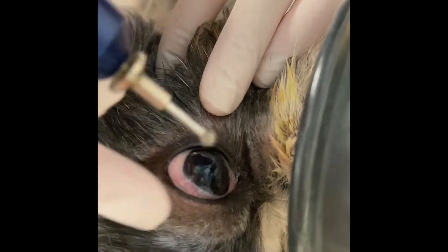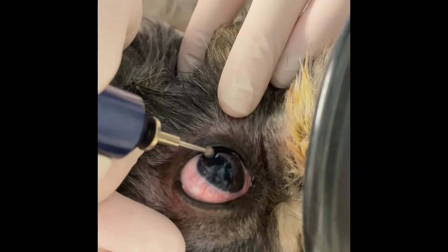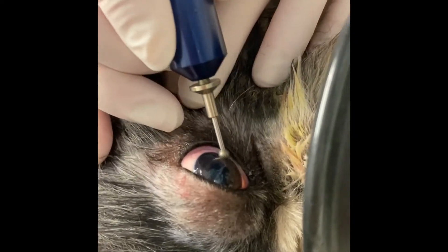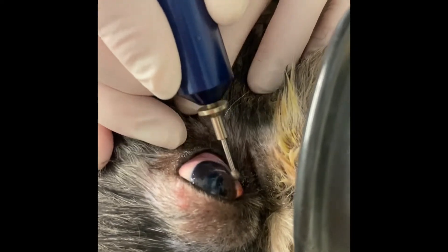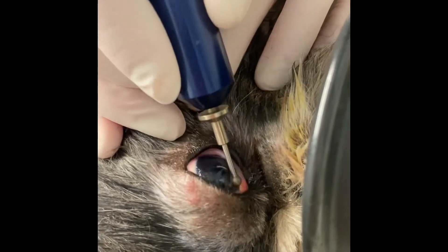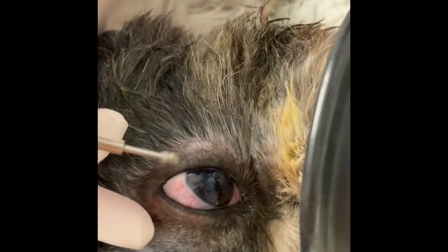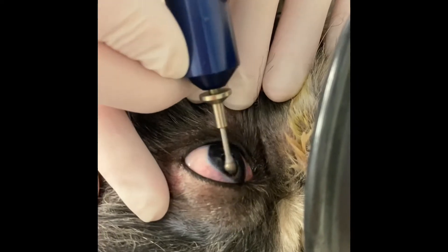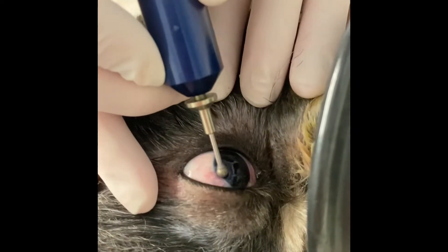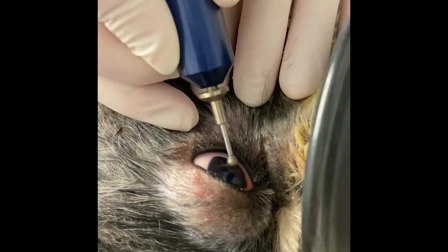The key to these procedures is not actually the complexity of the procedure, but truly feeling confident in making your diagnosis of a superficial chronic corneal epithelial defect. By definition, these need to be superficial ulcers. If you can see any sort of indent or any sign of a deeper stromal ulcer, these should be considered as infected ulcers, and this procedure is unlikely to be the most appropriate one and probably not indicated.